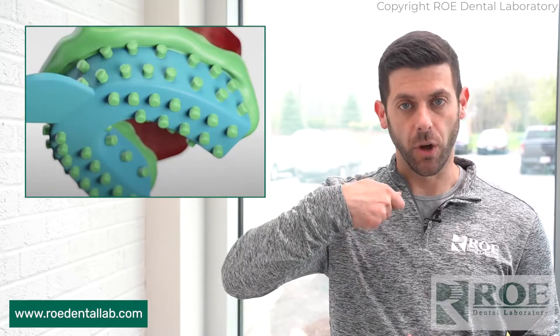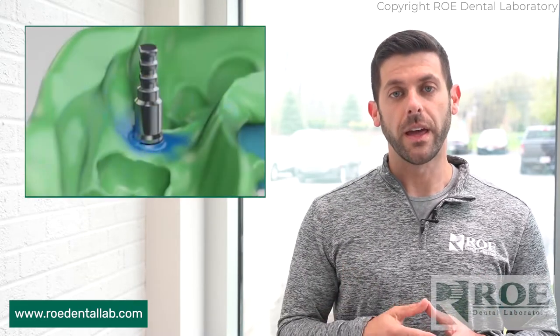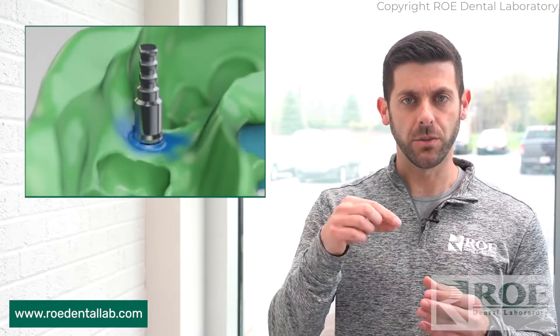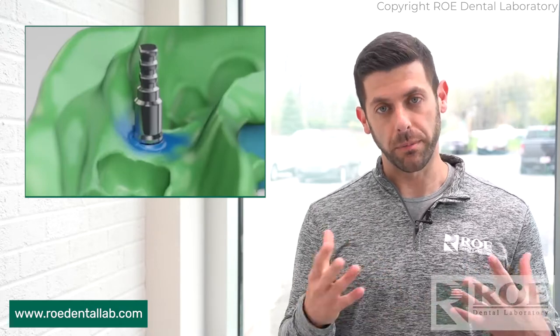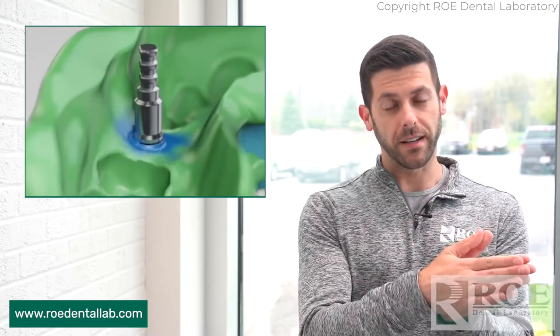Just take some wax or maybe some Teflon tape and put it in the screw access hole. That way you won't get impression material in the access there. Once the impression material sets, slowly remove the impression tray, then unscrew that impression post and send it to the lab. We'll deal with sticking it back into the impression — there's a certain way that post is going to fit into that impression, so let us figure that out. It will probably be the most accurate way for us to do it. That's your closed tray technique.